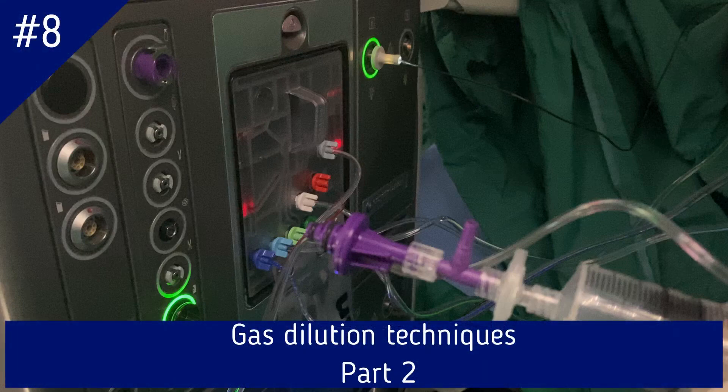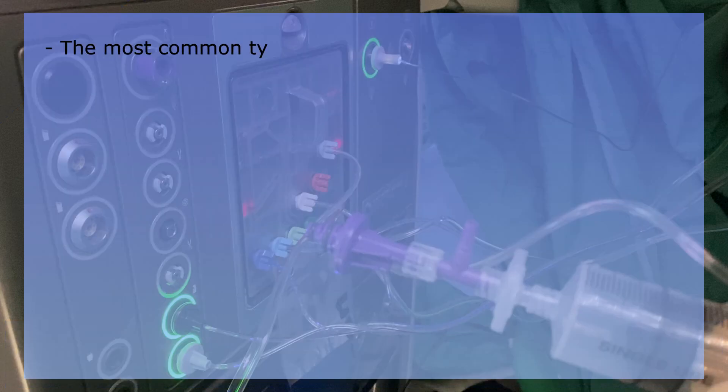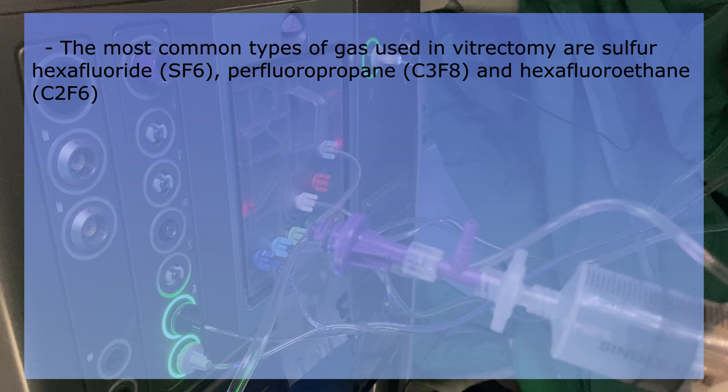Hi, this is Anfisa from RetinaCoach, and today I'm going to talk about gas dilution techniques in retinal detachment surgery. The most common types of gas used in vitreous surgery are sulfur hexafluoride (SF6), perfluoropropane (C3F8), and hexafluoroethane (C2F6). In this video, I will focus on SF6 and C3F8 gases.